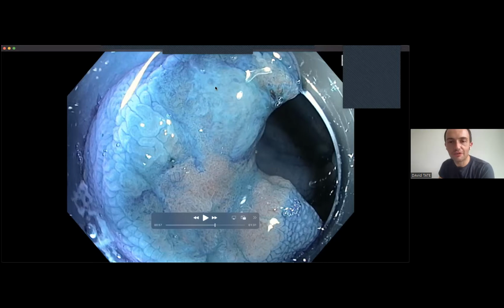The reason you're not saying the top part is because the top part has no structure at all, and in fact it is ulcerated. So in fact it's the top part, even though the bottom part, I'm totally with you, is probably, if we were looking at chromoendoscopy, JNET 2B. There is some structure there, right? But it is not maintained fully. At the top, there is no structure at all.